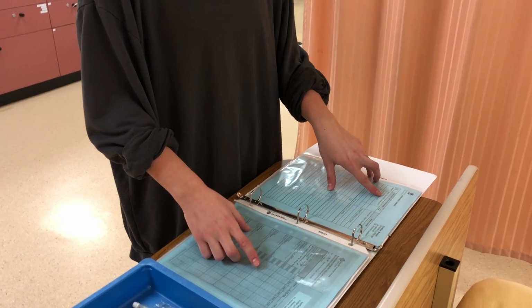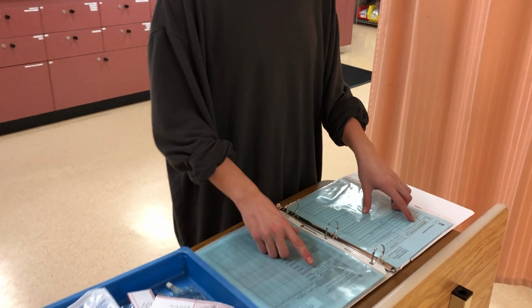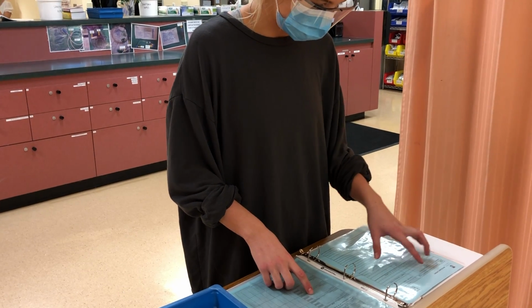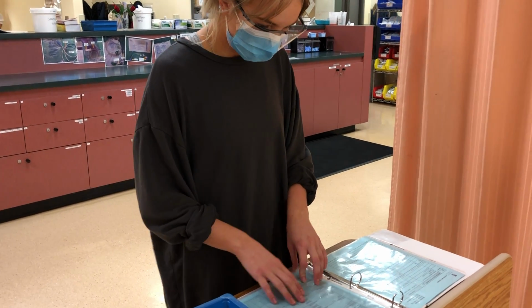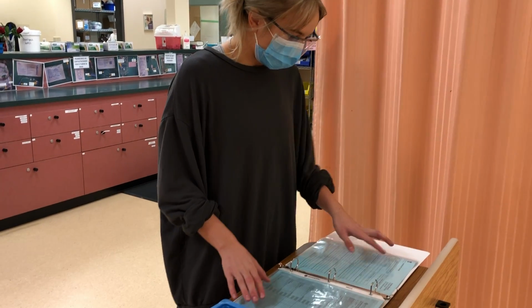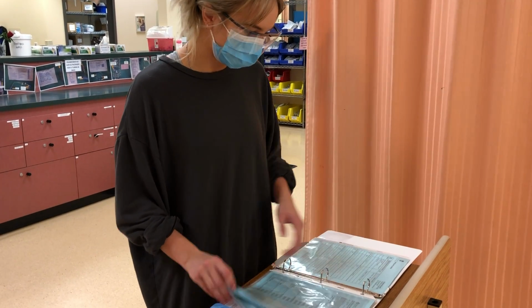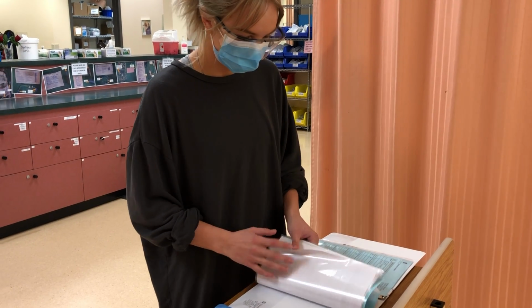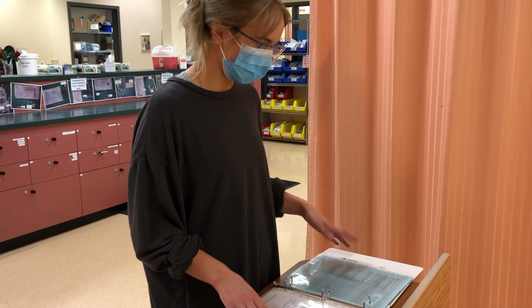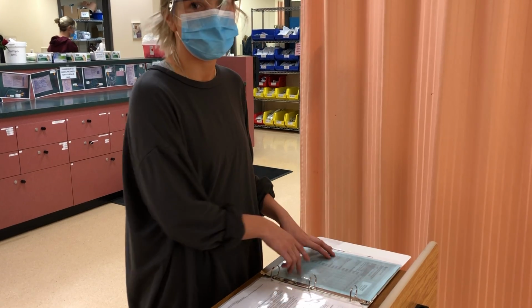So we have an order for insulin Humulin R, continuous IV, to run at 2 units per hour. It has been ordered for today and now, and it has been signed here. We're also watching that we're getting to that goal blood glucose of 6 to 10. I've checked the diabetic flow sheet to see his last blood glucose. Okay, so now I've matched the physician's order to the MAR.